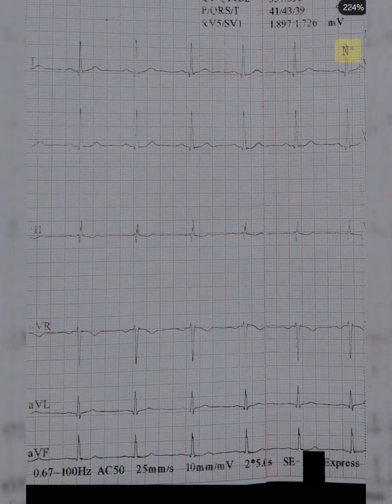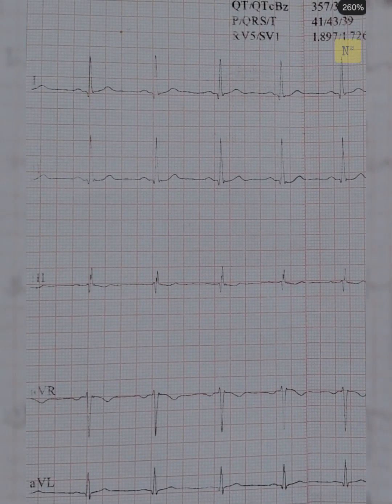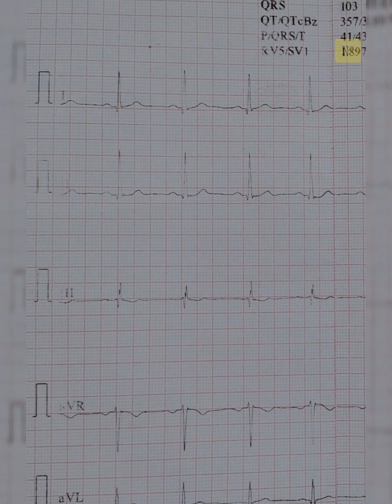Now there are certain nomenclatures we should know. Whenever we are reading any graph or ECG strip, you see some curves going up and some curves going down. It has been taken as a dictum that a curve going upwards from the baseline is called a positive deflection.